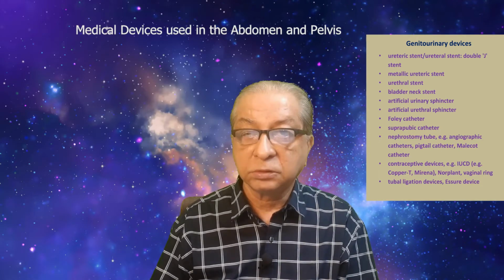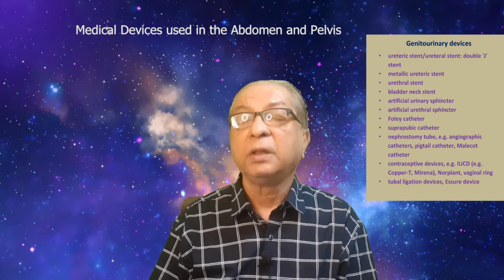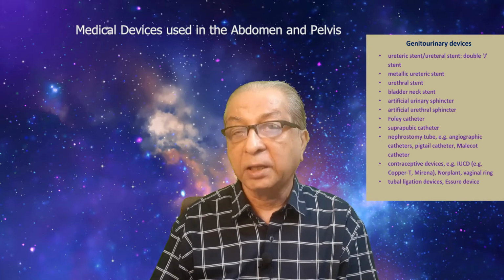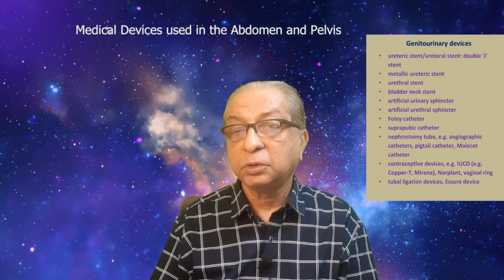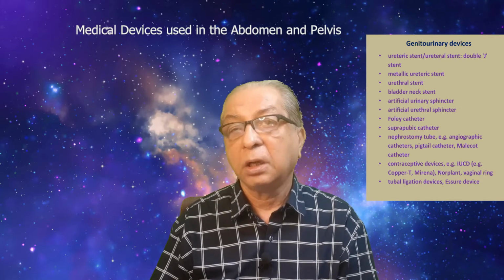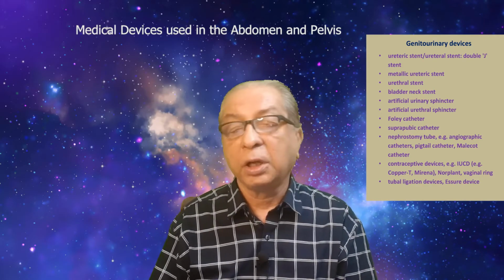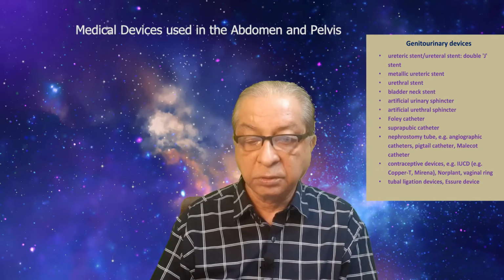Then some devices are used in the kidney directly to drain. Then for dialysis, the approach to the kidney or the peritoneal cavity is in the abdomen.